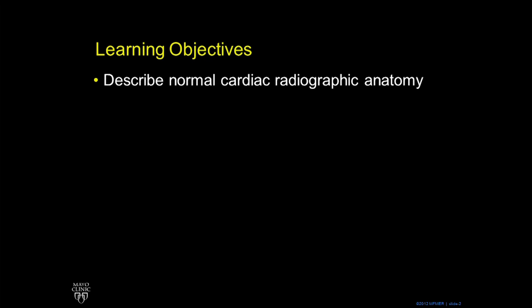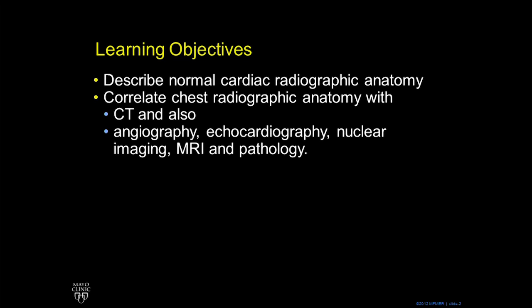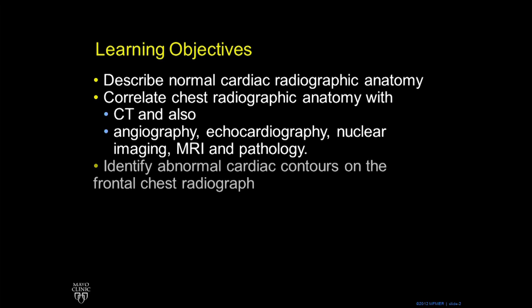The learning objectives are: we're going to look at the normal cardiac radiographic anatomy. We're going to correlate the chest x-ray with CT scan mainly, but also with conventional catheter angiography, echocardiography, nuclear imaging, MRI, and also even pathology. And we're going to show some abnormal cases of abnormal contours on the frontal chest radiograph.